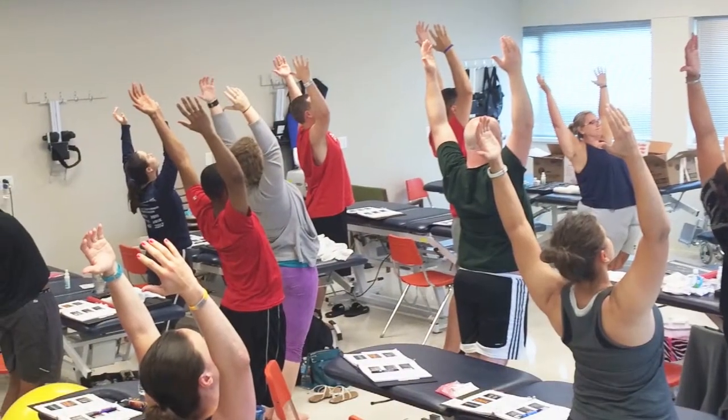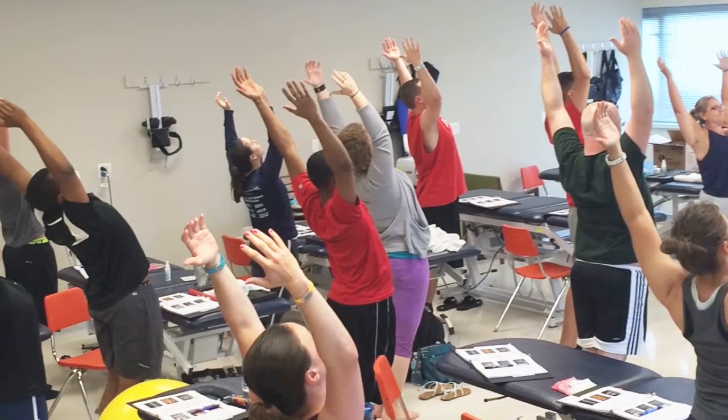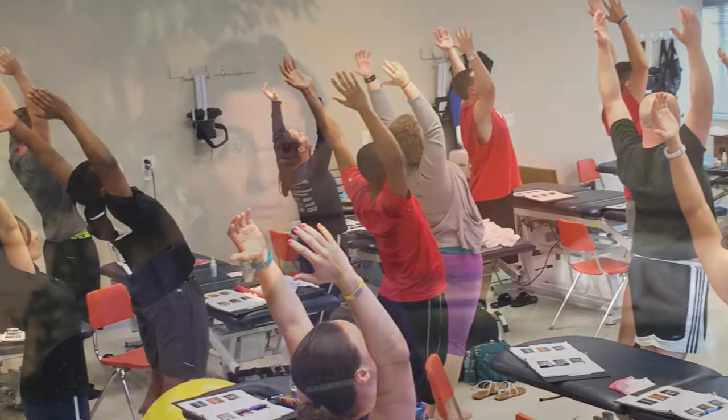Our Module 2 training, 14 hours, is what we consider to be our advanced clinical educational course. We expand on the concepts that we start teaching in Module 1, but we also go much deeper into the actual clinical applications of doing soft tissue work via the Graston Technique instruments.